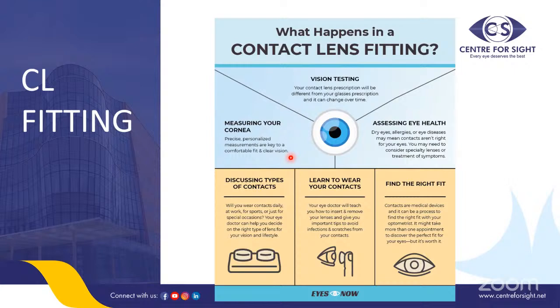Second important factor is every patient that comes for a contact lens fitting requires thorough counseling on how to maintain contact lenses. For example, how to use contact lenses, how to keep and store them, tips on avoiding tap water, tips on avoiding rubbing your eyes, and counseling the patient on what higher risks the contact lens predisposes them to. For example, higher risk of infection and higher risk of corneal abrasion, if these measures are not kept in mind.